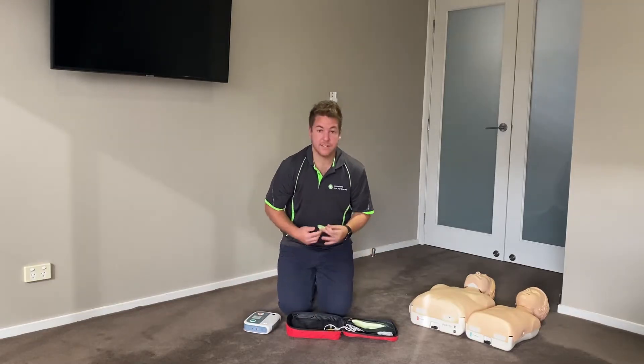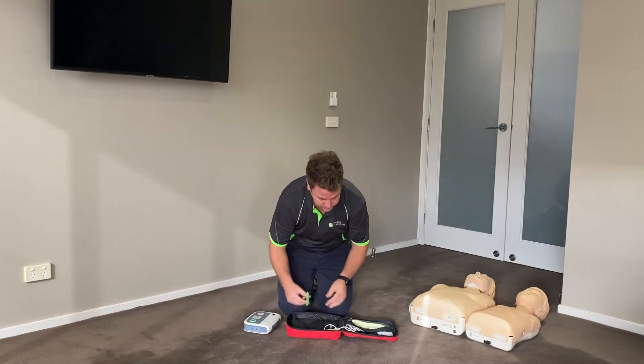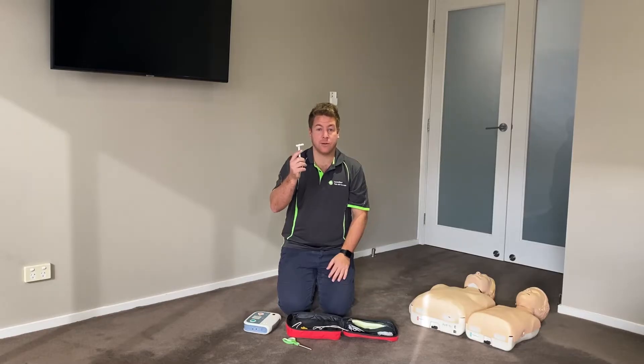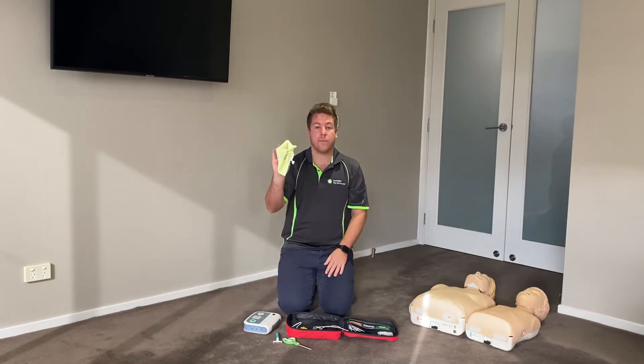You will also have scissors, which are used to cut any clothing. You will have a razor, which is to shave excessive hair where you need to place the pads. And a cloth to wipe any water, fluid, or sweat that might be on the skin.